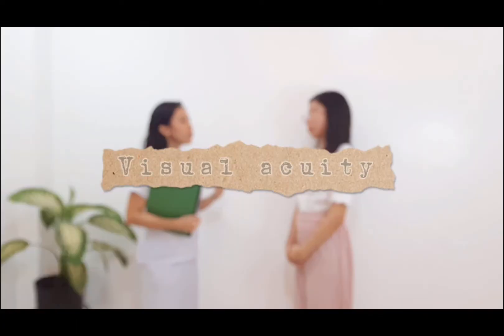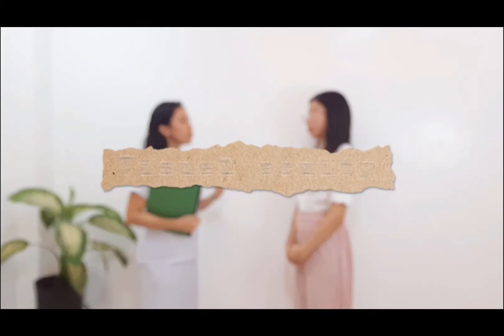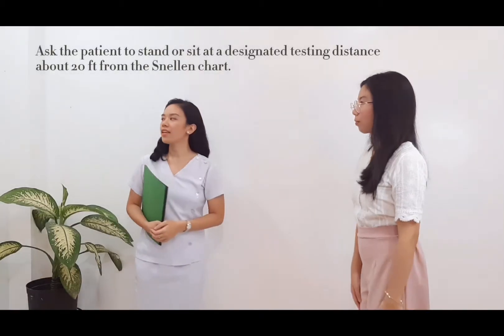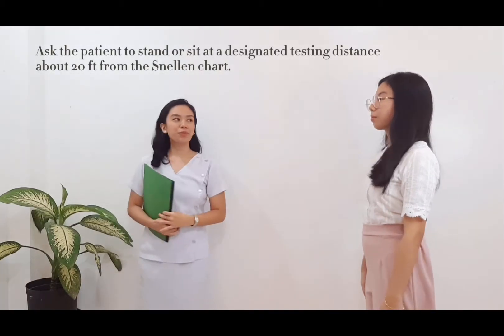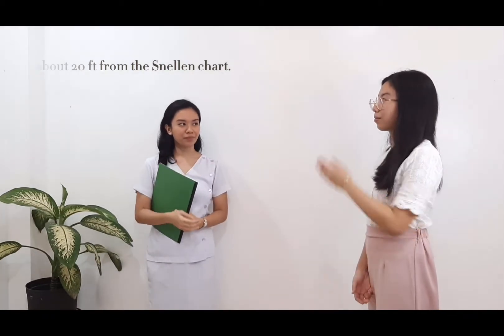First is distance visual acuity. Good day ma'am, so today we will be examining your eyes. Can you please take a step back, then occlude your left eye and read the lines for me.